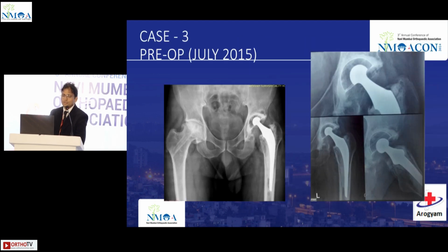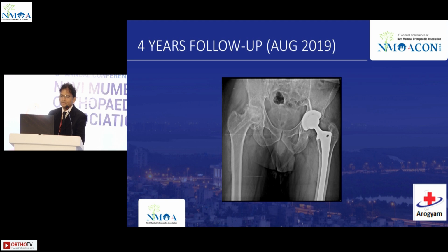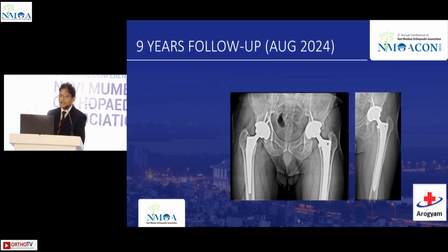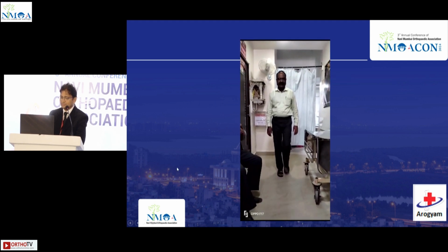Another case, this was a police inspector with a loose implant, a Charnley done a few years back in 2015. You can see the zones, it is loose in 1, 2, 3, 4, 5 zones. Loosening is seen there. So we again tried the no osteotomy technique. We used long osteotomes and prepared the canal, and we could fortunately get away with an uncemented solution stem. This is the follow-up of the same patient. The other hip also landed in avascular necrosis. We replaced that also, and now he is back to his regular activities.